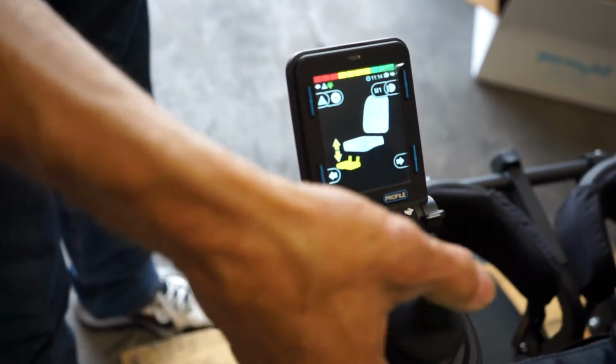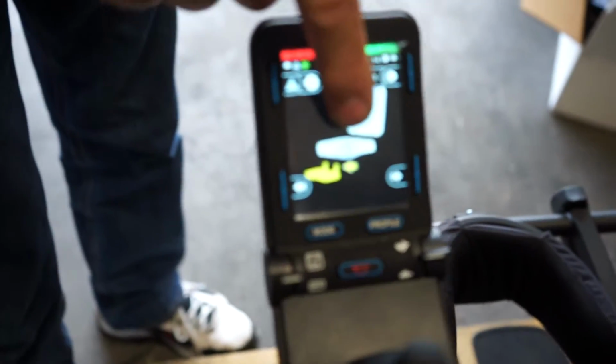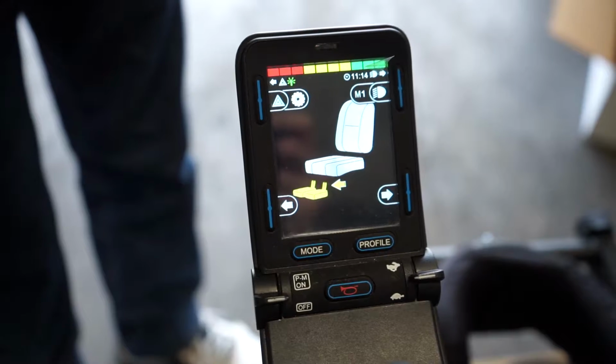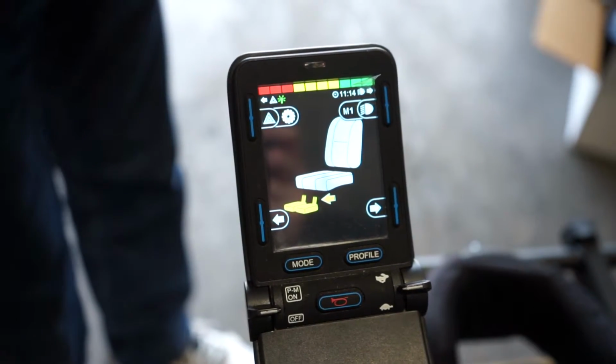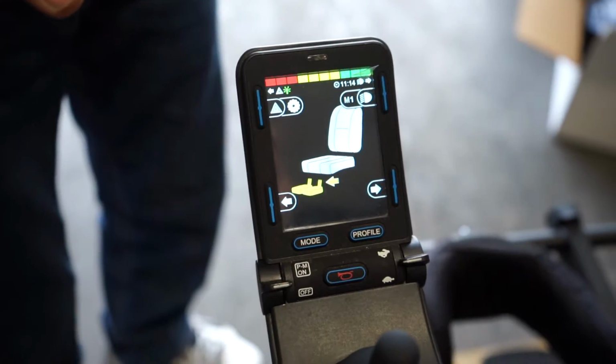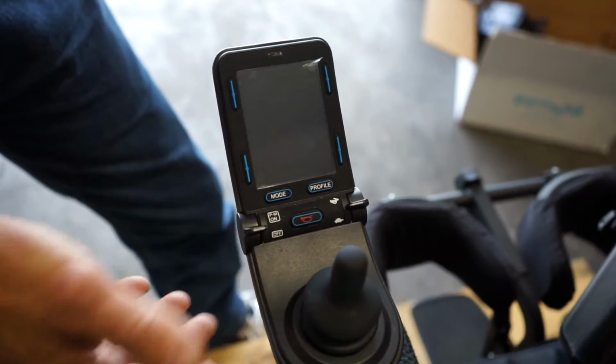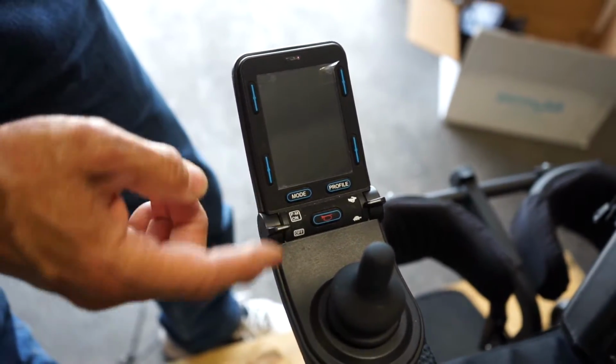If the arrow is like this on the side, the feet are going out. They're going to go from inside the chair to standing forward, like if you had a broken leg. So, all right, just to give you a recap again, real quick. Power is off over here. Power is on.